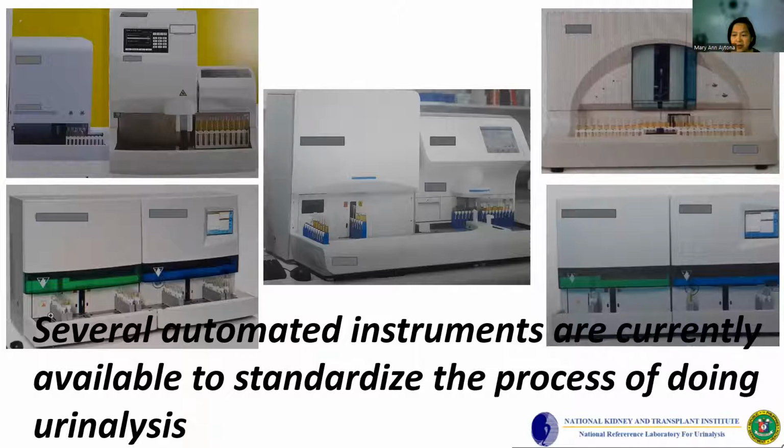Clinicians also often appreciate the quantitative report and the precise cut-offs established by the lab for their patient population when making treatment decisions, as opposed to the qualitative or semi-quantitative 0, +1, or +2 system often used for dipsticks and manual microscopy.